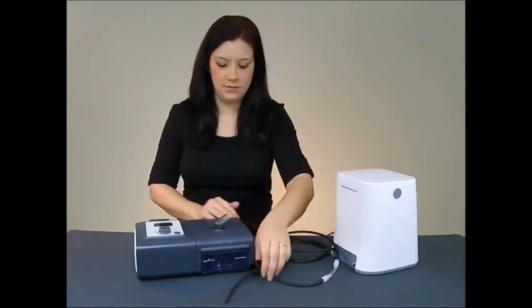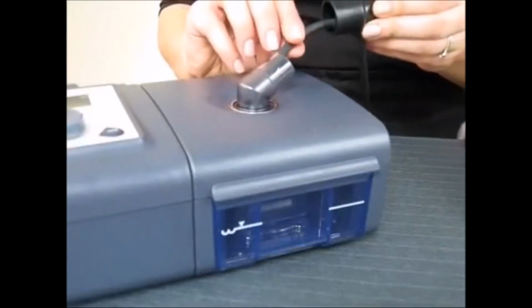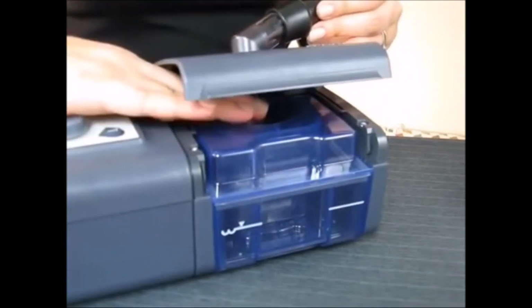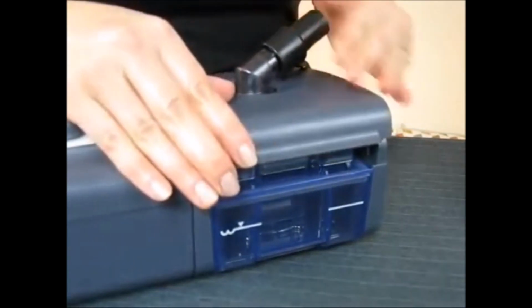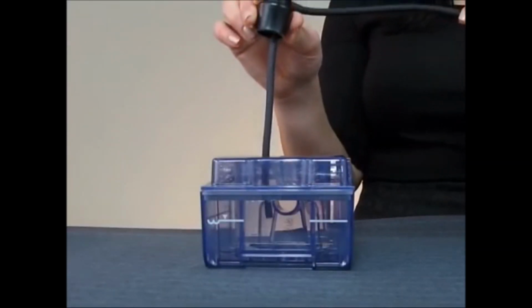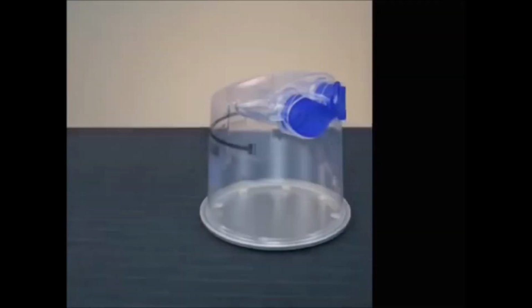Do this by removing the main CPAP hose from your humidifier port and feeding the small hose in through the opening. Continue feeding it until the black plastic fitting is firmly in position on the spot where your main CPAP hose once attached. It may be necessary to trim the small black hose to get a good fit. You want it to rest on or near the bottom of your humidifier reservoir.